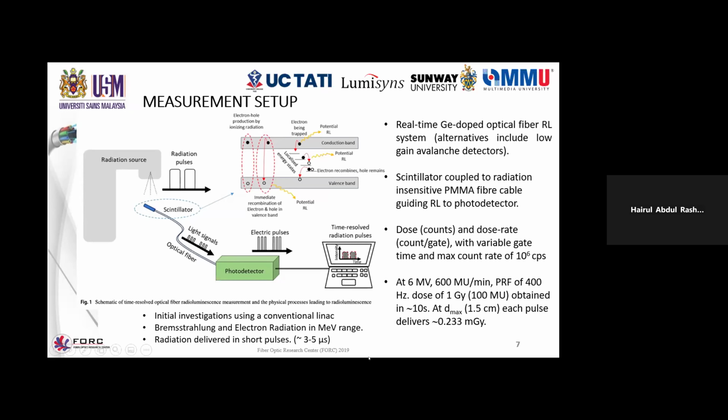So this luminescence is later detected by the photodetector, converted to electrical pulses, and processed further by some measurement software. And here is an example.